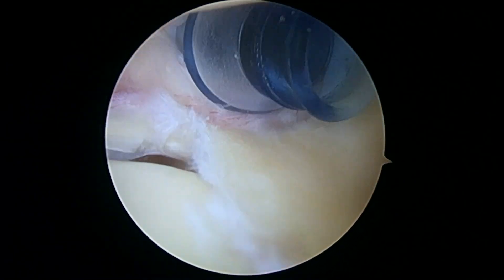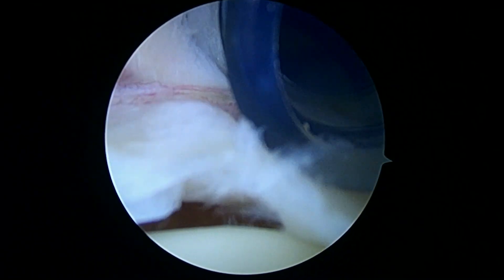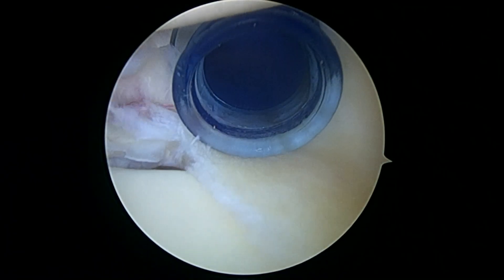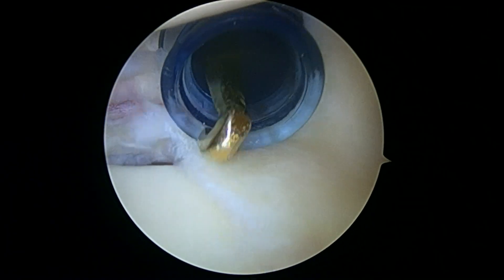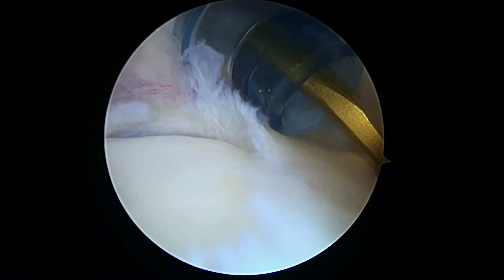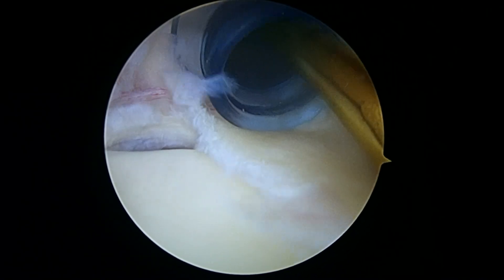This meets all the criteria for diagnosis for a slap lesion. Even without doing much with the cannula, we can see how that's loose — see how that lifts up there and we can see underneath it. We can use this as a probe and just further demonstrate. See that?